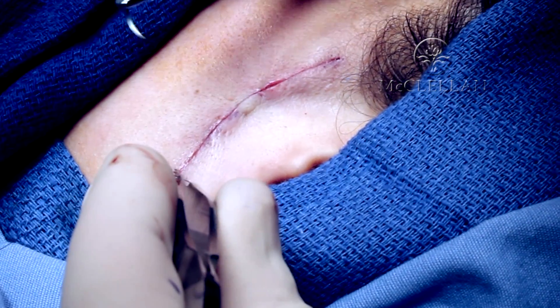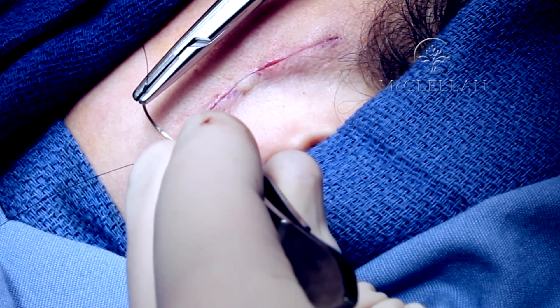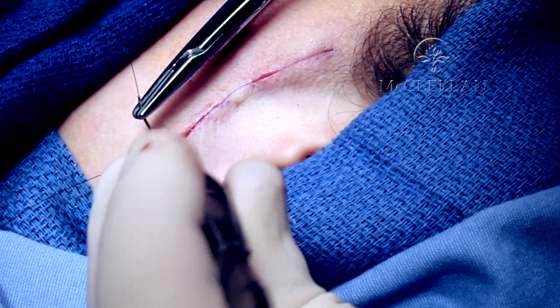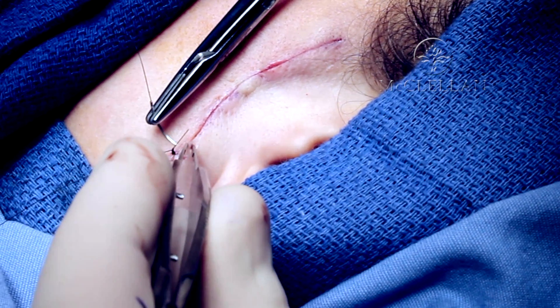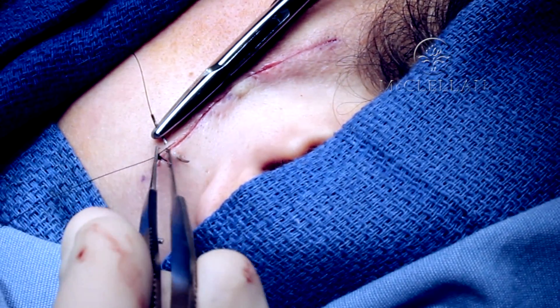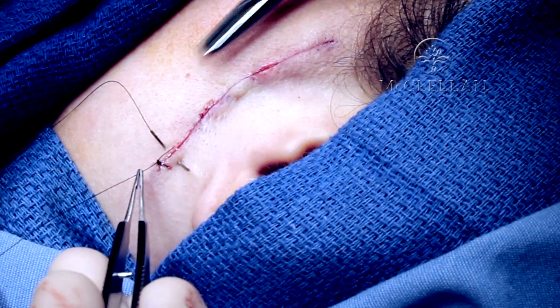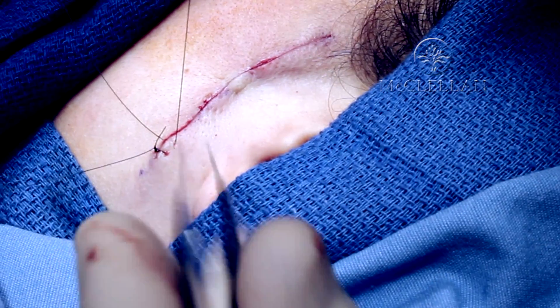As I prepare to take my second bite, I'll present the skin to myself. Here I'm lifting the skin up to meet my needle at 90 degrees. I'll be patient, I'll traverse, I'll pull out equidistant, and the needle will just sit there. If you've placed the needle properly, it just sits there, and you come back and rotate your wrist to get that needle to come out of the skin smoothly.